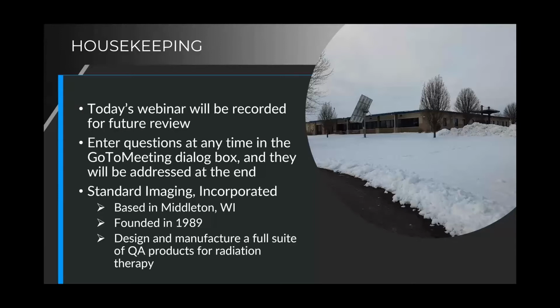We design and manufacture a full suite of products, including Phantoms, our Lucy Phantom for stereotactic, our X-ray line of ion chambers, from the smallest of the micro chambers and diodes to our large spherical chambers, a host of electrometers for various uses, our 3D DoseView 3D water phantom, our DoseView 1D water phantom, and a number of other software products as well.